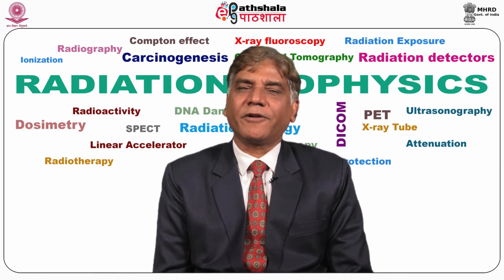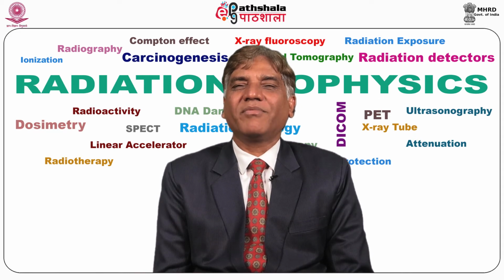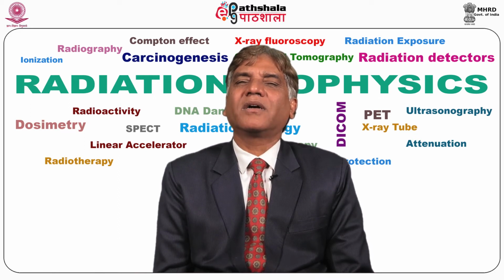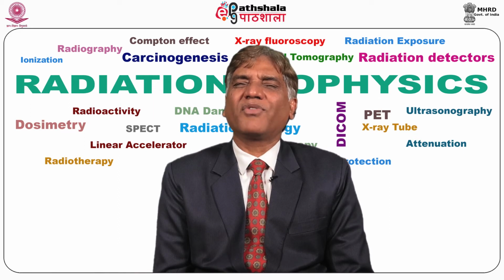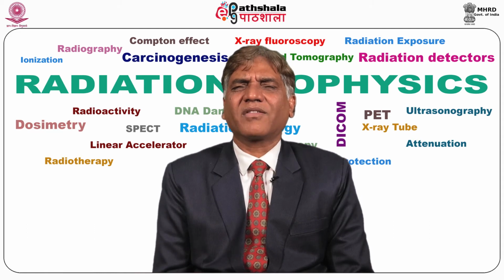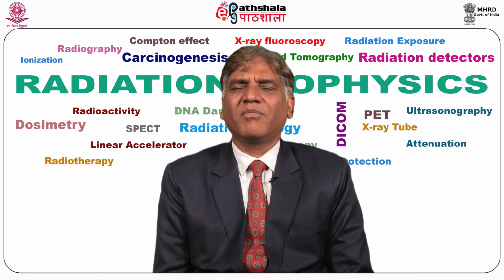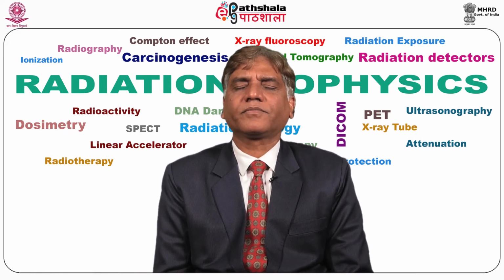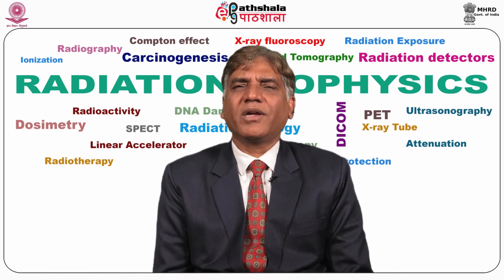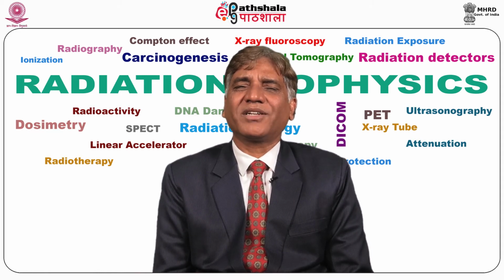To summarize this module, first of all, as I told you, ultrasound is the sound beam having frequency more than 20 kilohertz. Any sound wave having more than 20 kilohertz is known as ultrasound, and in ultrasound imaging 1 to about 7.5 megahertz transducers are mainly used. In fact, for cardiac, cardiovascular ultrasound, it may be about 20 megahertz or so, or even higher. When the ultrasound beam passes through the patient body, it gets attenuated, its intensity is reduced. This process is known as attenuation.